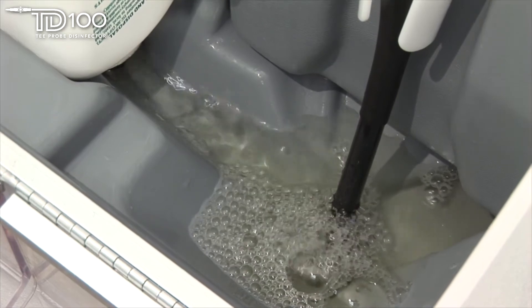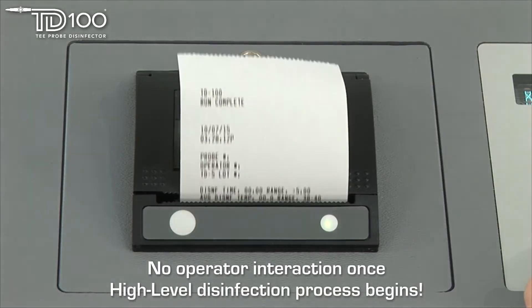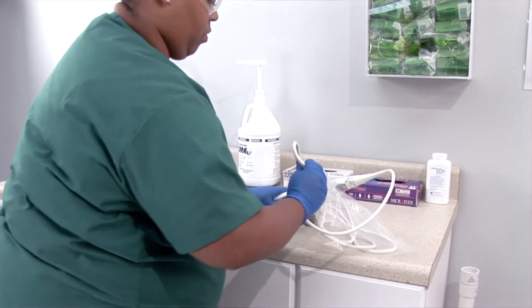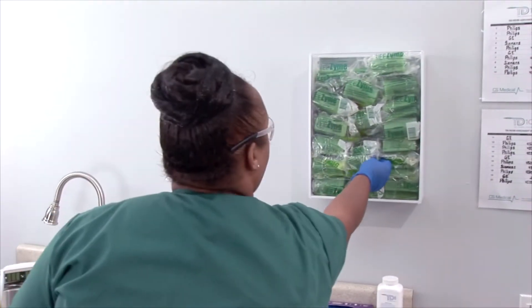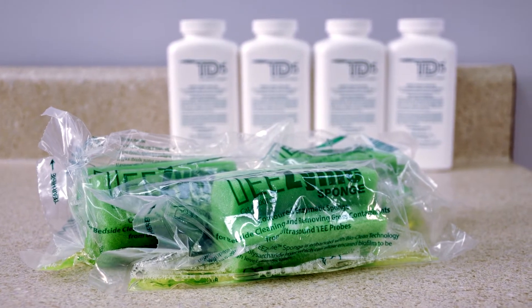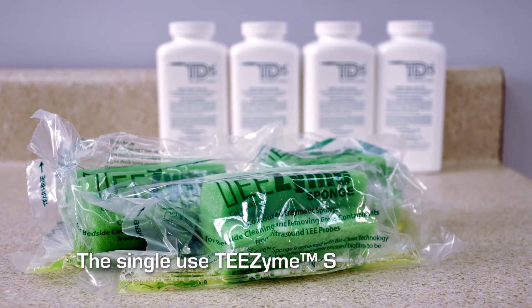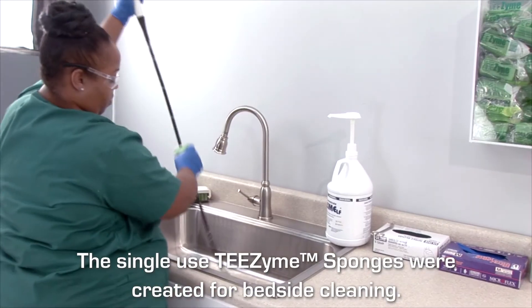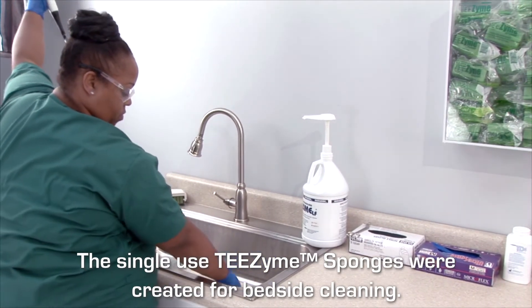The TD100 is simple to operate and requires no operator interaction once the disinfection process begins. When using automated reprocessor units, you should bedside clean the probe according to the manufacturer's instructions. CS Medical's T-Zyme contoured enzymatic sponges were specifically designed for TEE probes and this purpose. These single-use sponges can be used at bedside to remove soil and prepare the probe for a manual cleaning step, followed by high-level disinfection.